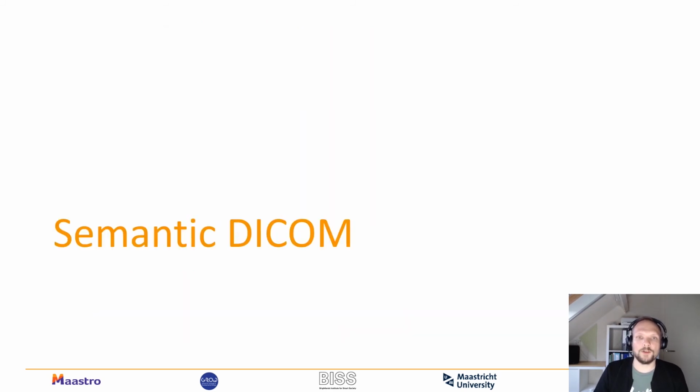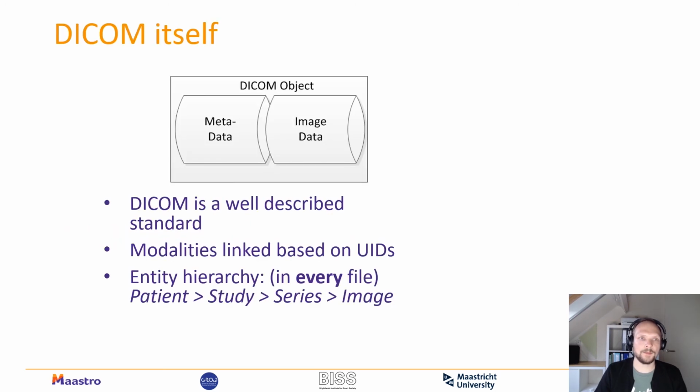So that's on local and central image handling, but that's purely on images. However, we have more information, of course, coming from EMR systems and so on. This is a slightly different topic, and I want to go briefly through it. If we look at the DICOM standard, we know that we have image data and we have metadata.